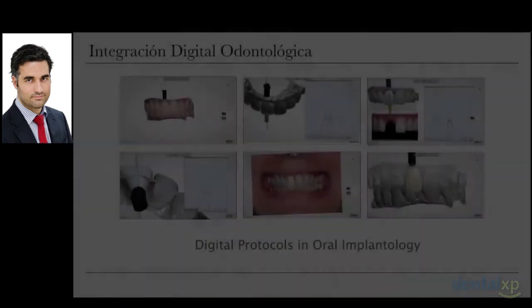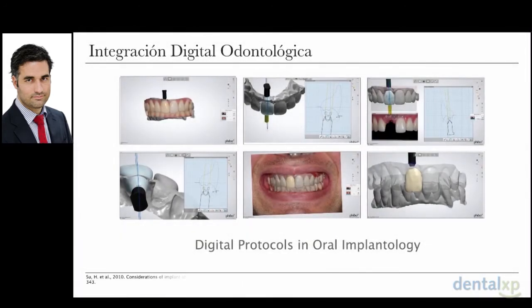If you remember, in the previous case, I had acrylic in my dental office. There's something that we should know: PMMA is a good material that doesn't release monomers, but the acrylic that you use in the dental office may release some monomers and may lead to some recession of your soft tissue.